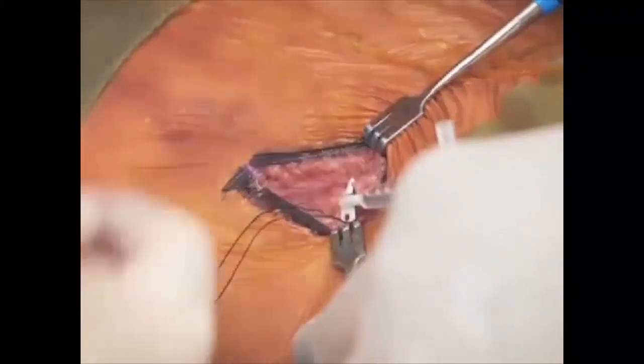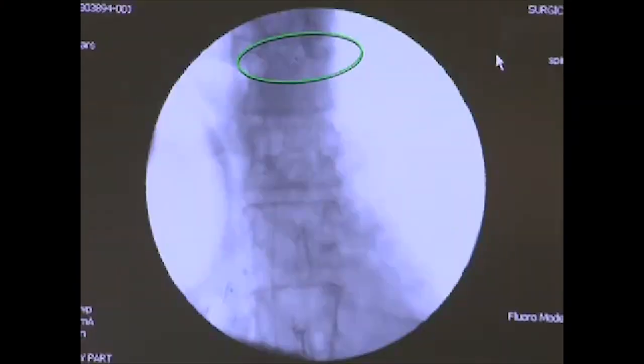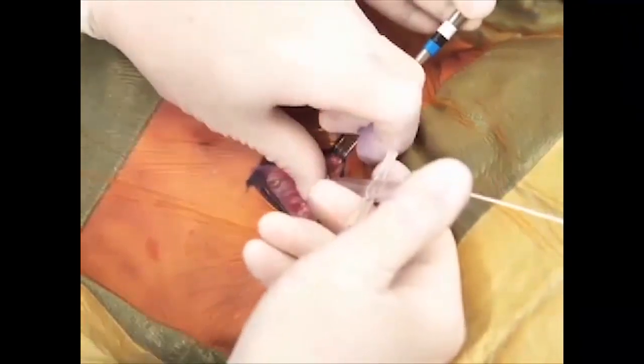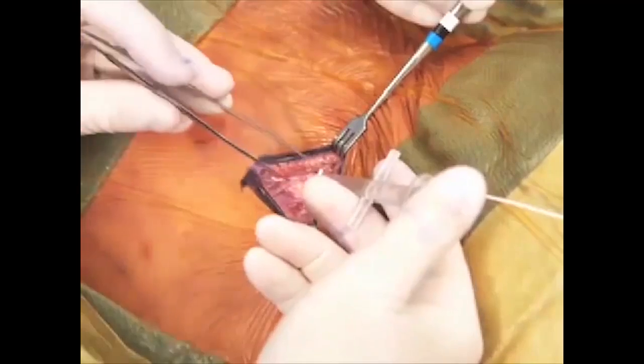Use tie-down sutures to attach the anchor securely to the surrounding fascia. Then confirm the catheter tip location using fluoroscopy. Position your fingers and thumb on the anchor dispenser, similar to holding a syringe, and release the anchor by using your fingers to pull the dispenser handle towards your thumb.